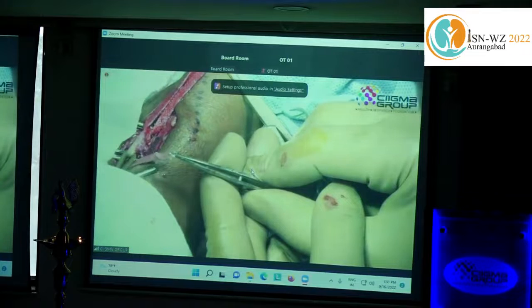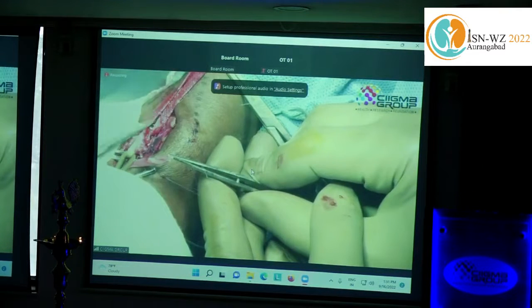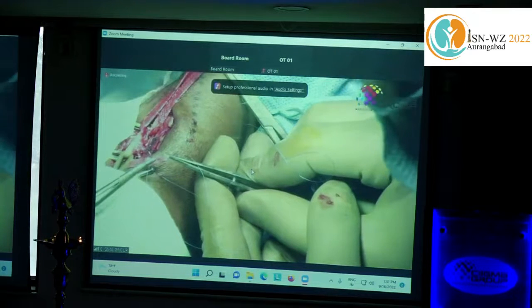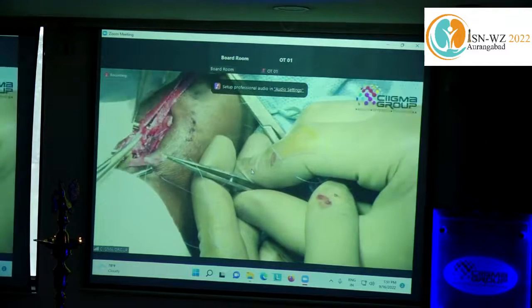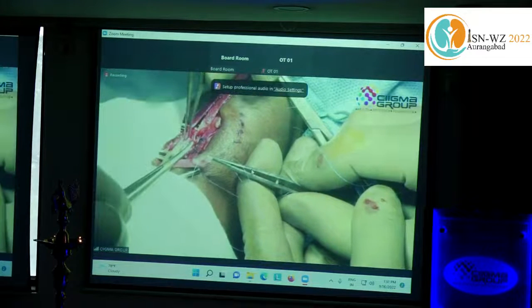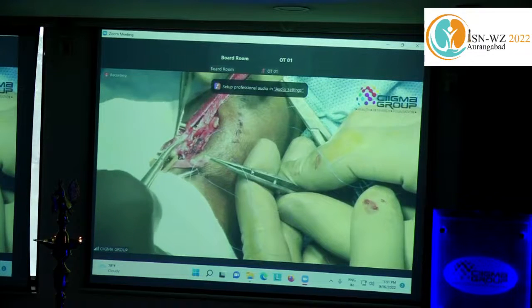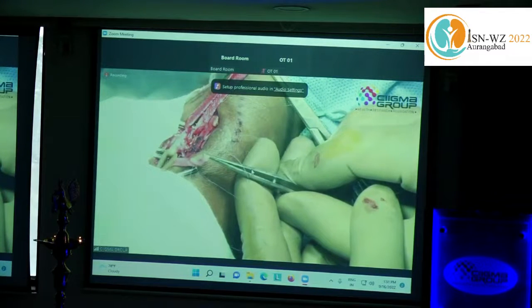I will start from this incision at the base of the venotomy, and obviously then I will start with the arterial side. So this venotomy starts from here at the base of the incision, and then I have to start from the middle of the artery, exactly the middle, so that both sides will approximate properly. And make sure you include each and every wall, adventitia, media, and intima, in your suture.